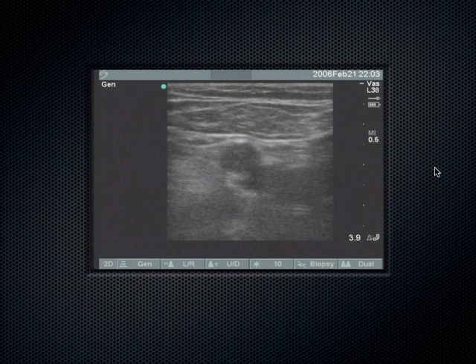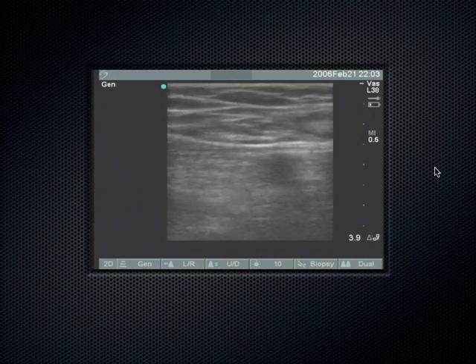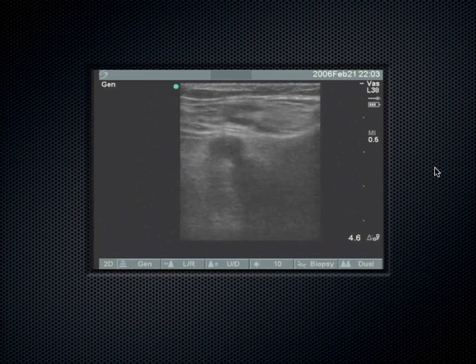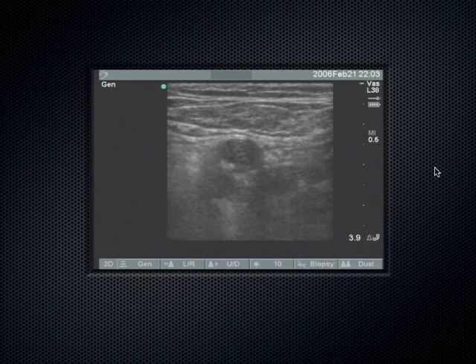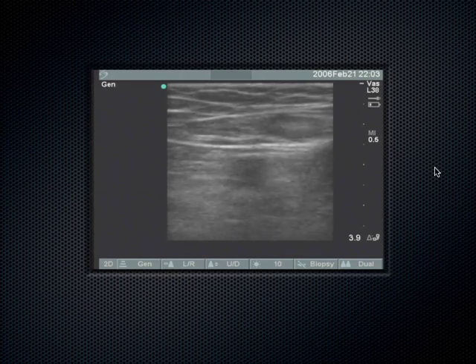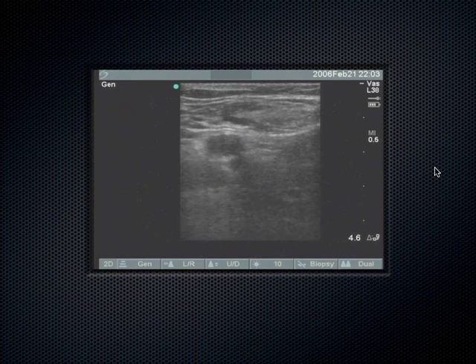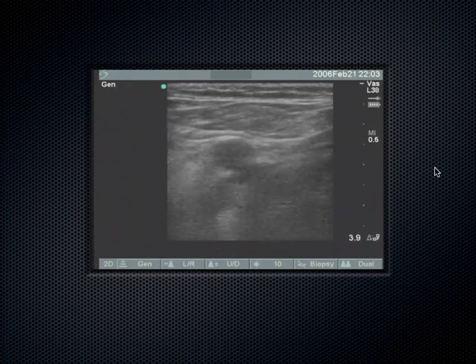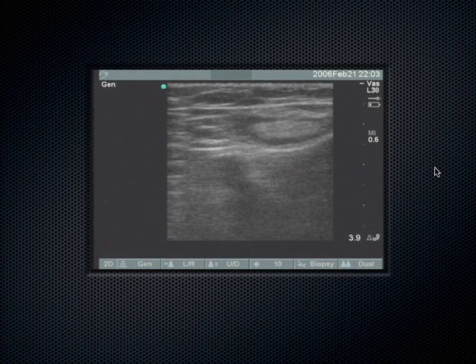But you know what? These patients come in, many times we're struggling clinically between, they've got this red swollen leg, and you're like, I don't know, is there an infection here? Is this cellulitis? Or is there a blood clot here? And so this is one way to help differentiate that. You look for a DVT, and it's easily compressible, there's no DVT, and then you see that thing up there. What is that thing up there? See, there it is, right there.